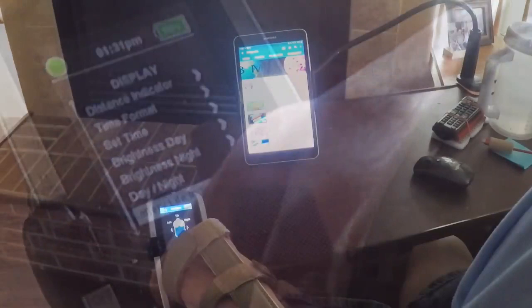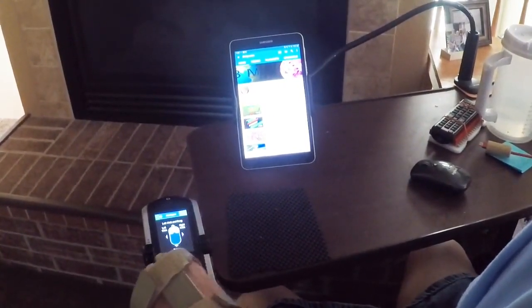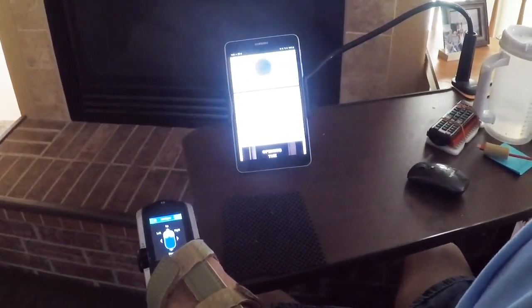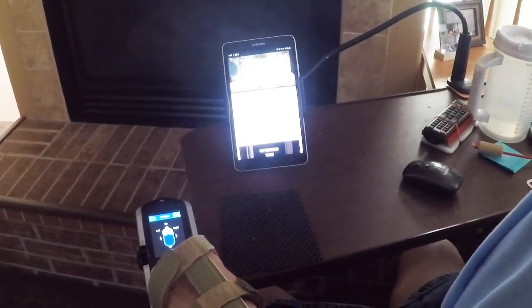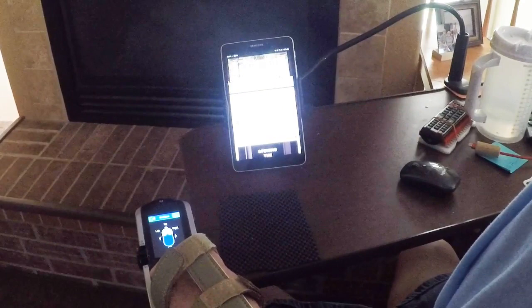You can even connect your PowerChair's joystick controller to operate the mouse on your desktop, laptop, tablet, or phone device. Setting up your joystick to operate these devices may depend on the devices themselves, so you might ask your local dealer to help you set up this Bluetooth feature for you.